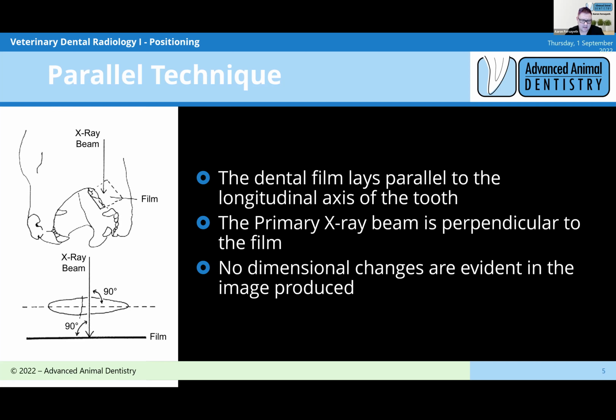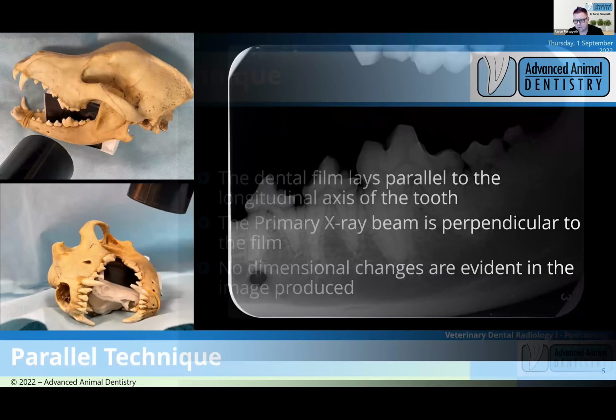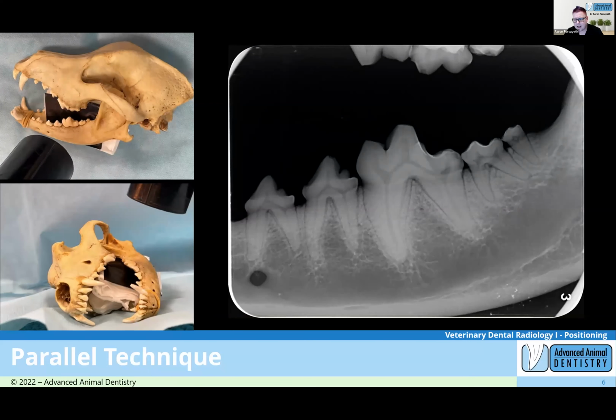So this is, as I said, an easy one. The next slide coming up, we took some shots last week. We took them live. Unfortunately, our patient was not alive. We took images, so the images that you see are the two images of the setup, and this is the resulting radiograph that was produced.